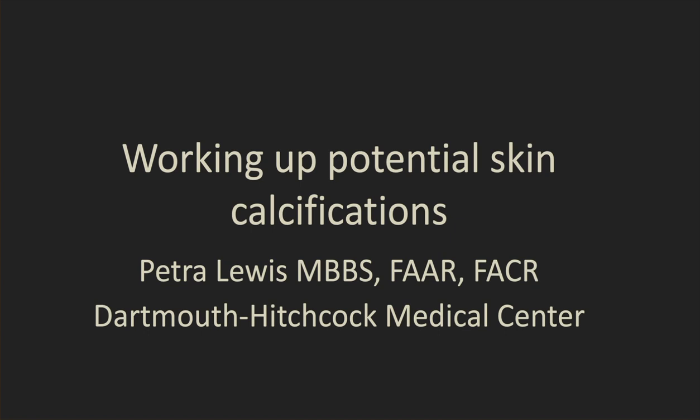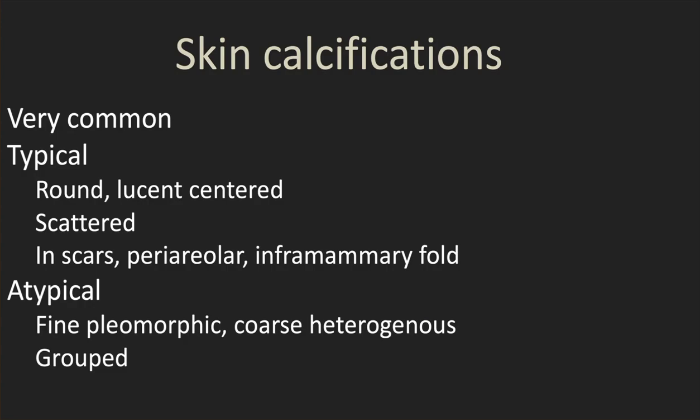Quick video on showing you how to work out potential skin calcifications on mammography. Skin calcifications are very common. They're typically round or lucent-centered, which are pretty much pathognomonic, generally scattered, but they can be more localized within scars, the periareolar area, or the inframammary fold. Sometimes they can be more atypical looking, more concerning — a little more pleomorphic or coarse heterogeneous — and they can be more focally grouped.